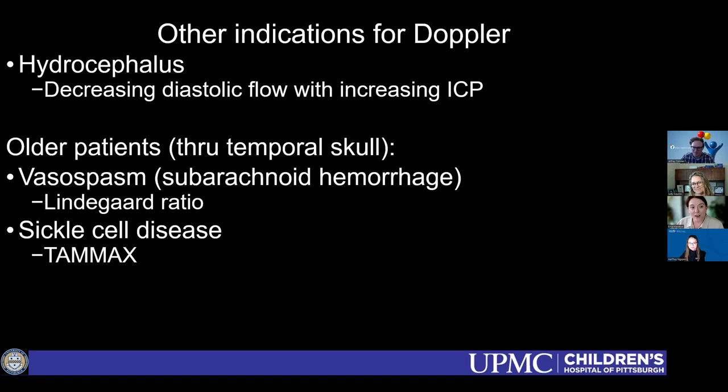But the very first time they asked us for a Lindegaard ratio, somebody actually trundled our big old non-visual TCD machine up to the PICU to do it. So now we actually do our Lindegaards visually. We have a GE machine that allows us to do visual TCDs and do them beautifully. If you are going to be starting to do Lindegaard ratios in your practice, you probably want to touch base with one of your neurosurgeons though, because that Lindegaard ratio is very important and you have to be reporting the right numbers. And the number that you report is different than the number you report for your sickle cell TAMMV.